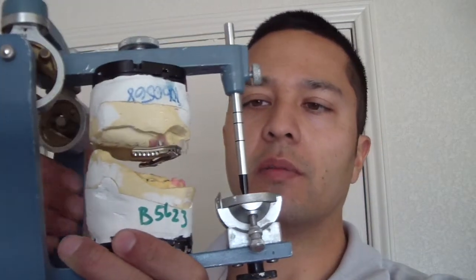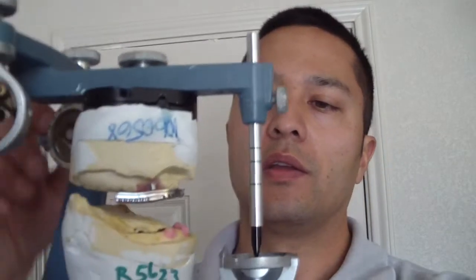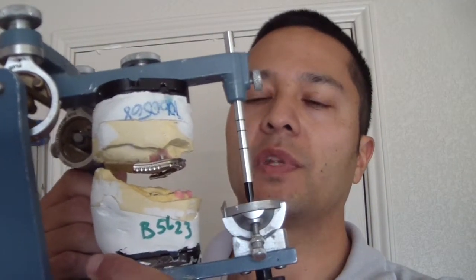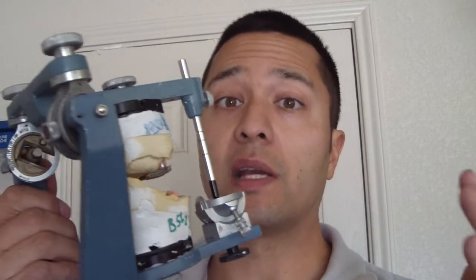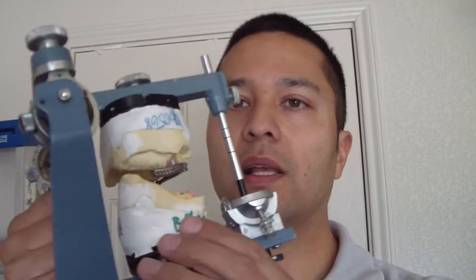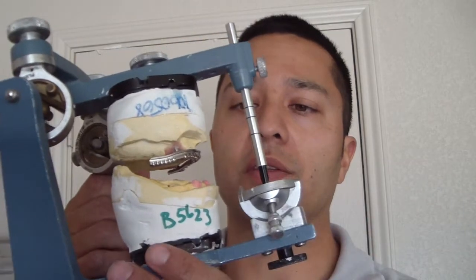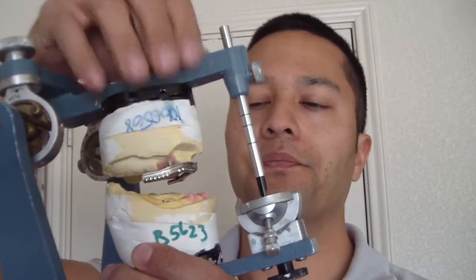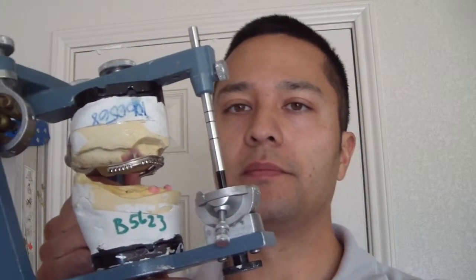She's going to be opposing a complete mandibular denture, so instead of cutting this and shortening the cantilever, we're going to use the idea that her ability to apply force through a mandibular denture is reduced compared to natural dentition. So we're going to leave it at that length, since she's not going to be able to create significant forces on it to fracture it — fracturing that piece being our main concern. We're leaving it for now. The next stage is going to be a wax try-in. Cheers.